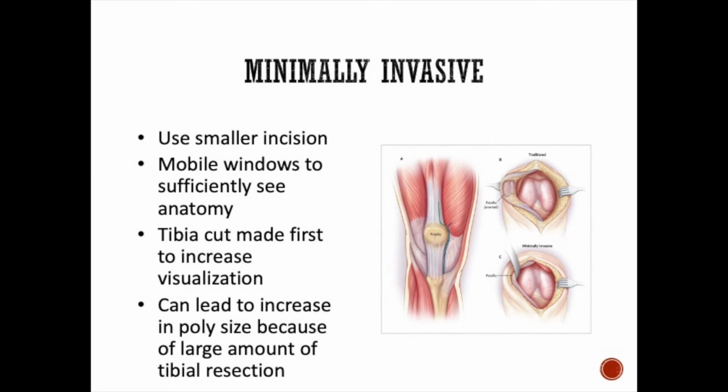The minimally invasive techniques in this image here were sort of minimal exposure where you could just barely see the distal femur, again designed to spare soft tissues. However, the retraction for this particular surgery was so intense it would actually rupture more and create more problems with the extensor mechanism than if you had not done this approach. So this really has fallen out of favor almost entirely.